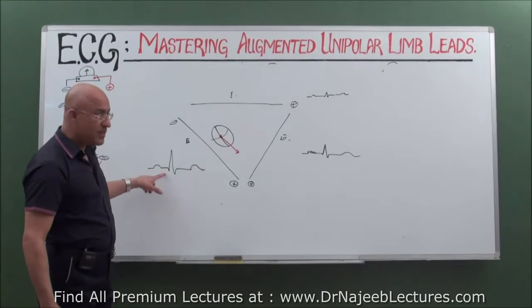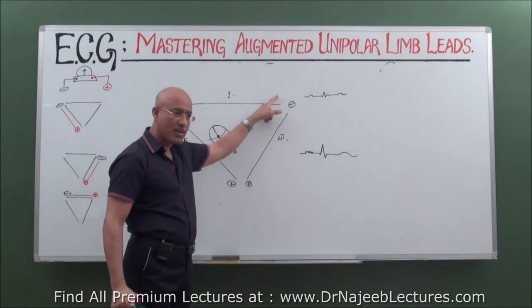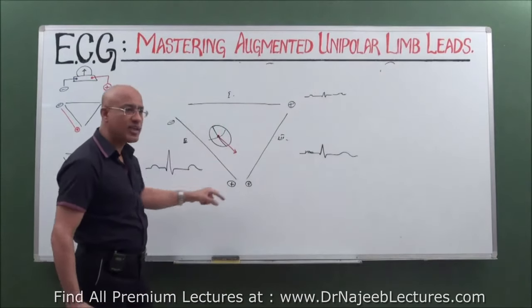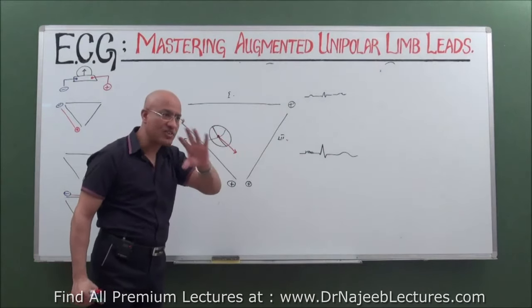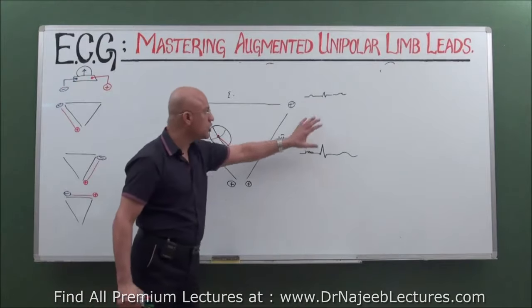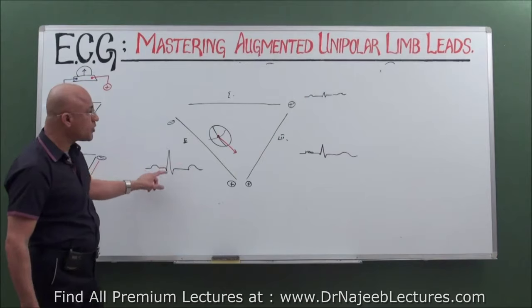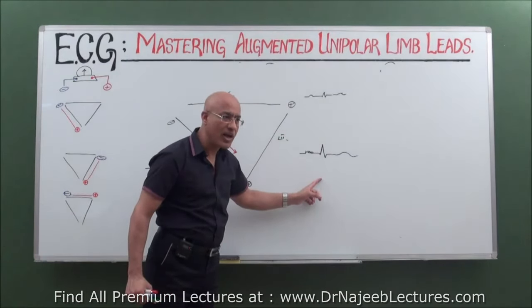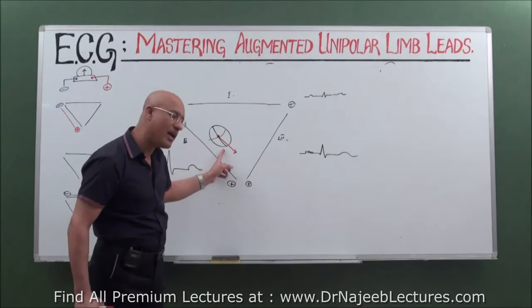So in a normal, healthy person, the ECG pattern in lead number 2, 3 and 1 will be dominantly positive because these leads have their positive ends either down or left. Clear? But still, even though mainly these three leads show positive deflections, the magnitude of deflection is different. Why? Because the leads are looking at the same electrical activity from different angles.